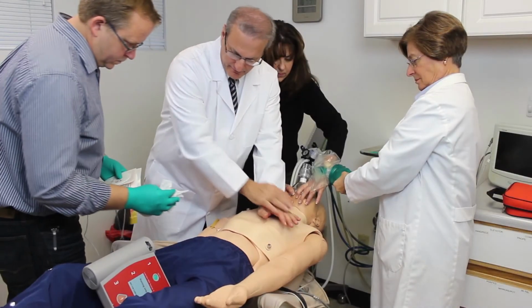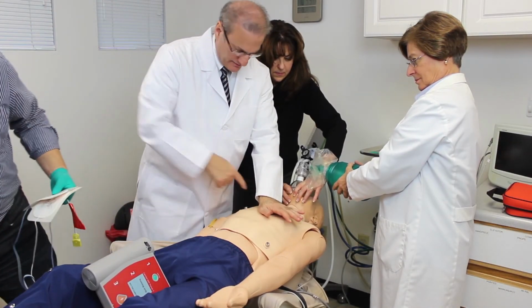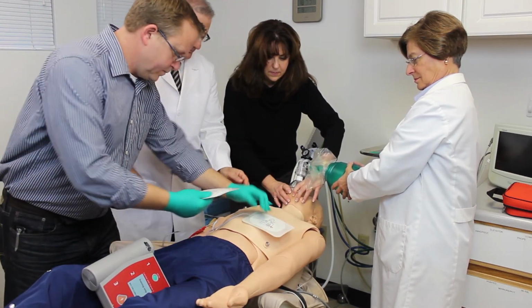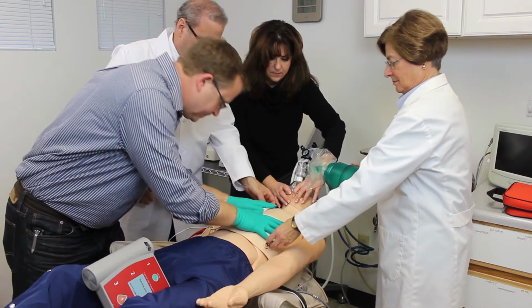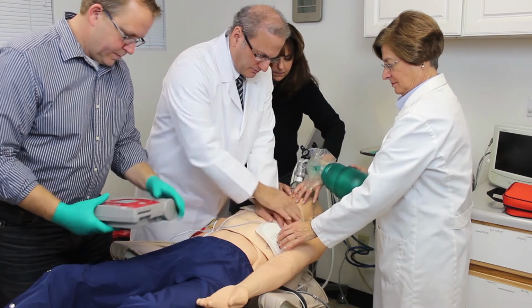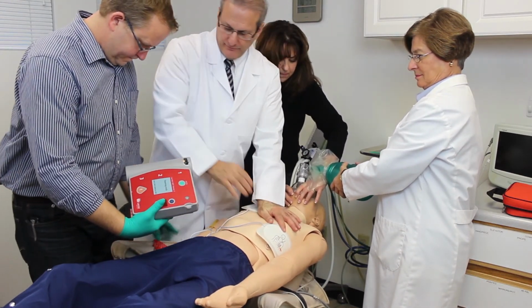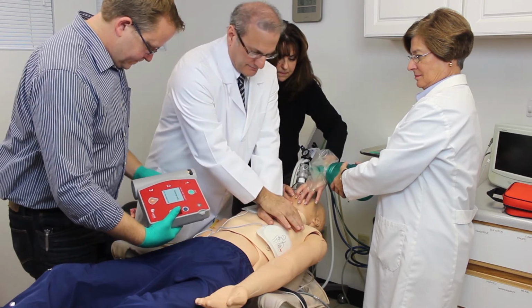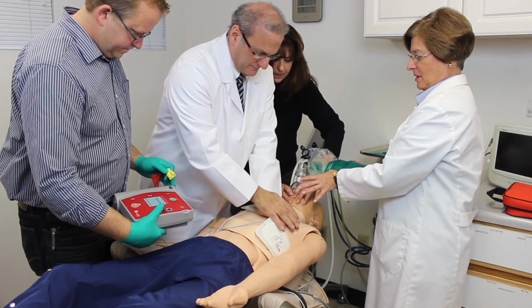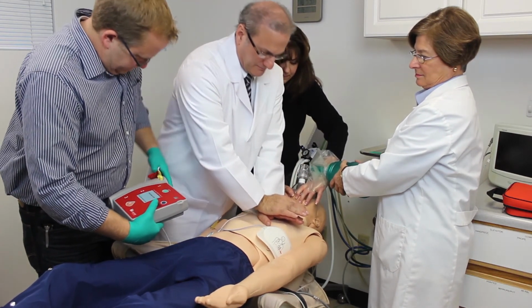When we set up the AED, be sure to have good visualization of the chest and wipe it off. Do not use alcohol since it's flammable. Do not have any free-flowing oxygen over the area where the defibrillation is taking place. Do not use the AED designated for adults on children age 8 and under unless pediatric pads are not available. Do not use the AED on a person wearing nitroglycerin patches or other patches. Remove those patches with a gloved hand prior to placement of the AED pads.